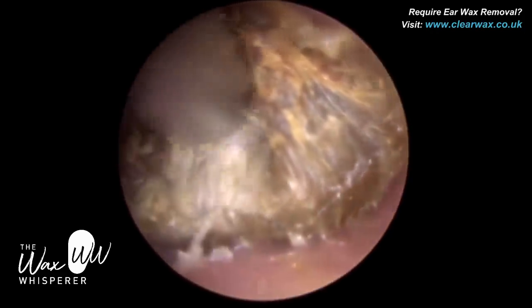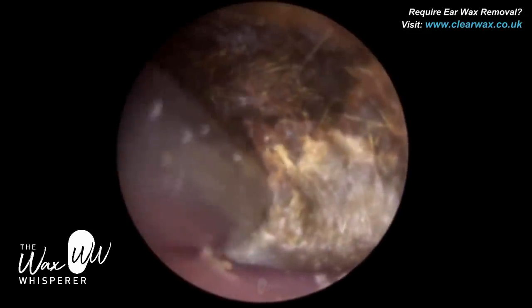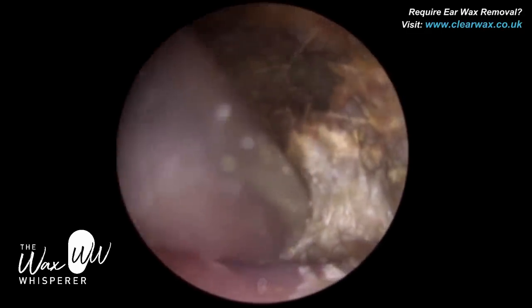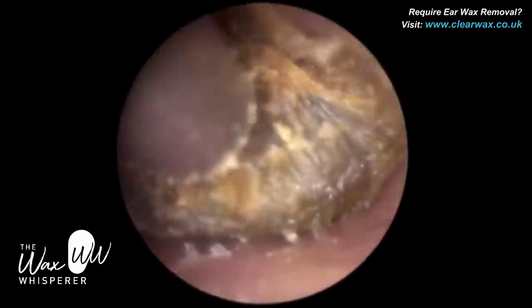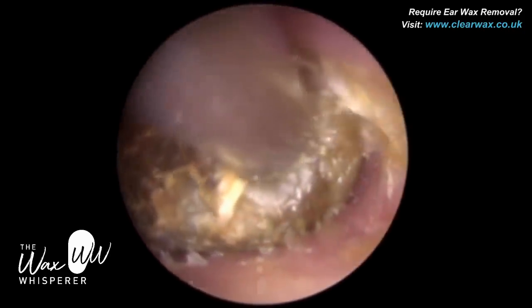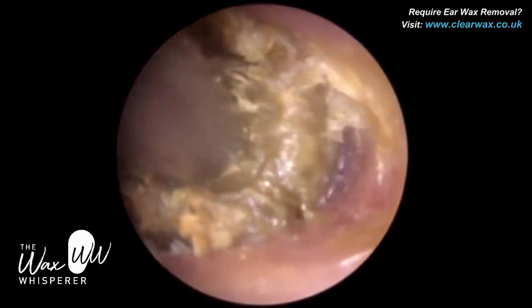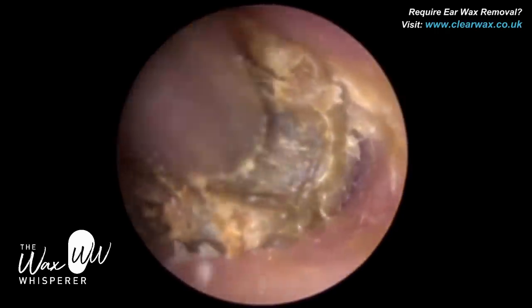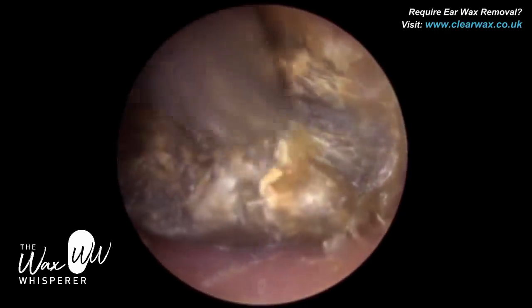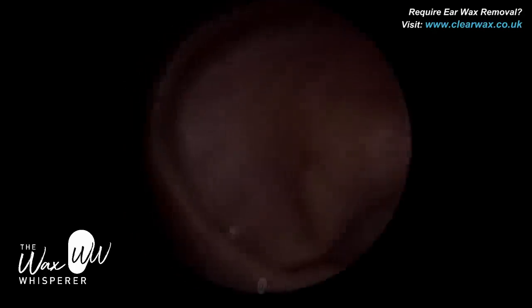In a moment I'm going to use an earhook and go into the ear with a bit more force — but still without making contact with the ear canal wall. Although I need to be forceful, whenever I perform earwax removal I'm trying to be gentle. I've had trauma in my own ear when I was younger, so I know how sensitive the ear is from first-hand experience — not only as an audiologist, but personally.